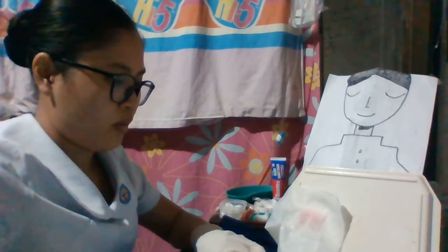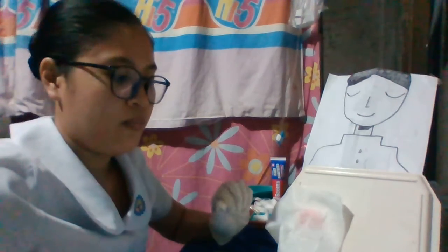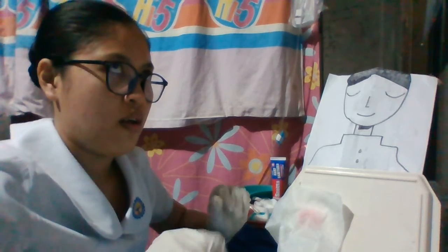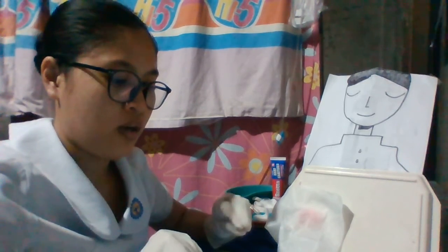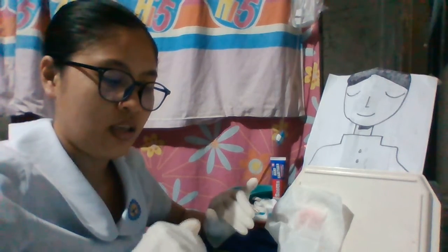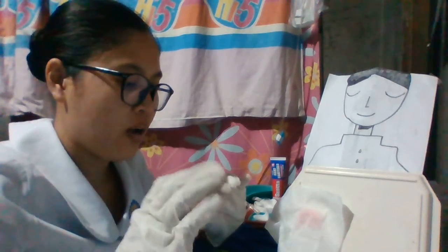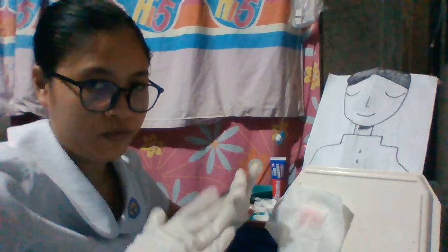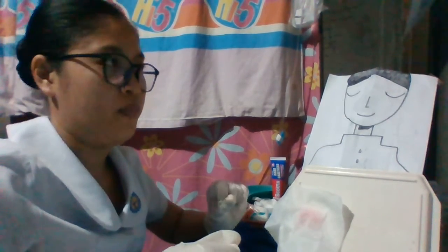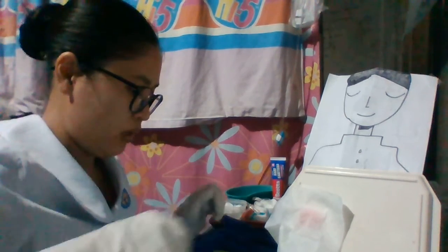For ease and quick succession, it's best to prepare the peristomal skin barrier ahead of time before doing this so that we can move easily and prepare quickly.